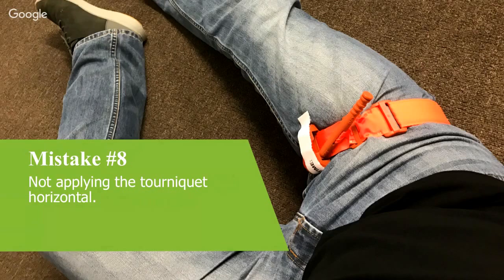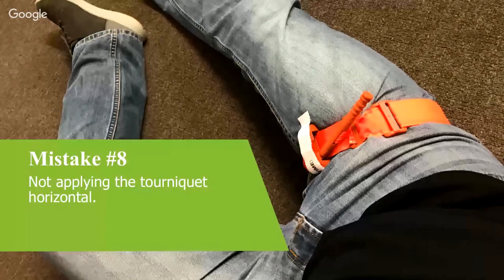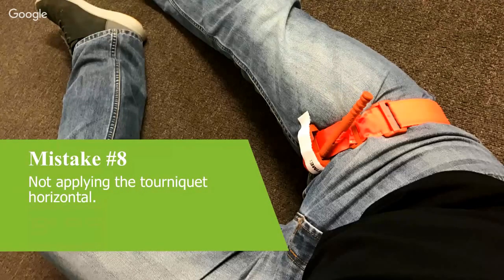You can crank that thing up tight enough to do it, but try and get into the habit of putting them on horizontally, straight across the limb, and that way they'll tighten down, they'll pinch in, and they won't migrate, and you won't have the opportunity for that tourniquet to make its way down, in effect be looser and lose control of the arterial bleed. Definitely get them on horizontal. Again, I've seen another one fail due to being too high up in the limb and on that angle.